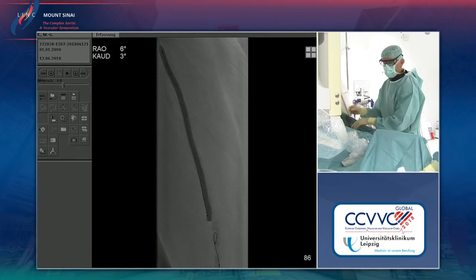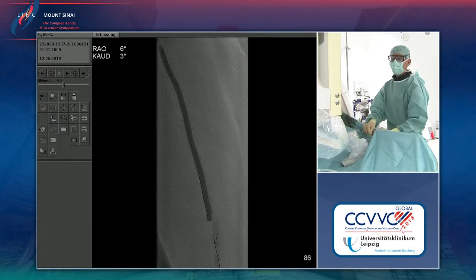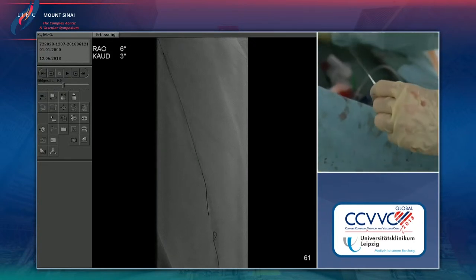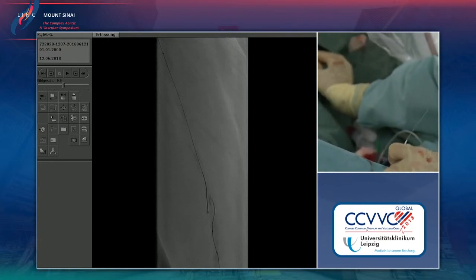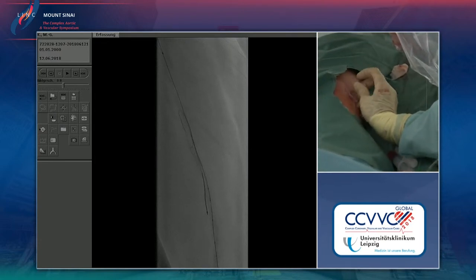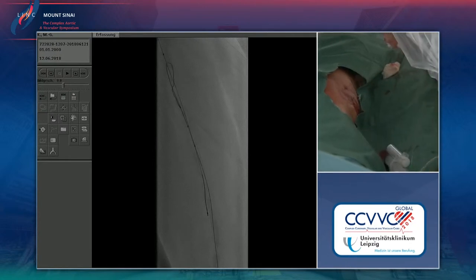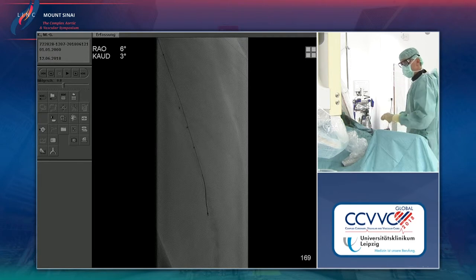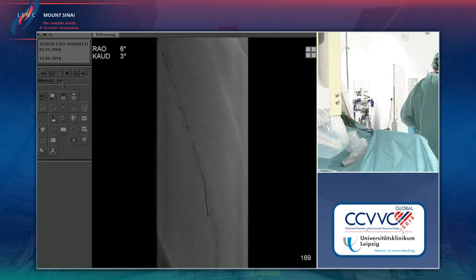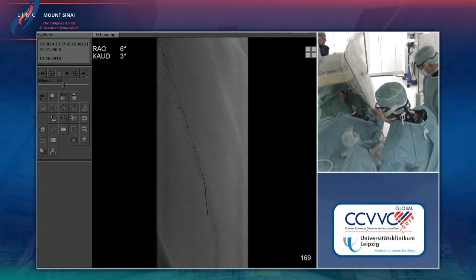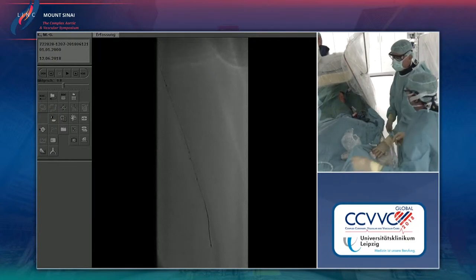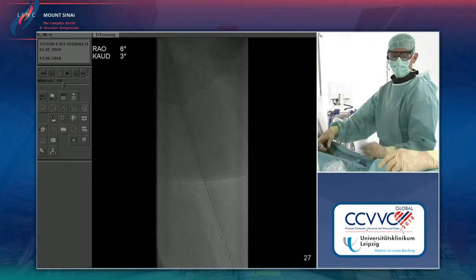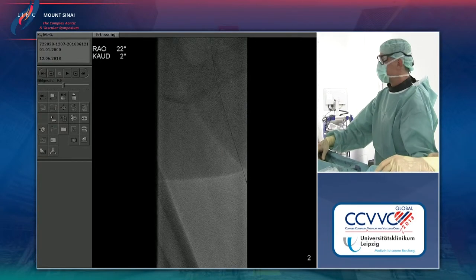No pain — maybe because of our local anesthesia. And now I try. Here the real plug starts. I think I'm now on the same channel as the one which we pre-dilated. But this was too easy — I was expecting something different, clearly with this calcium. Everything was described as very difficult, but it was actually very easy.